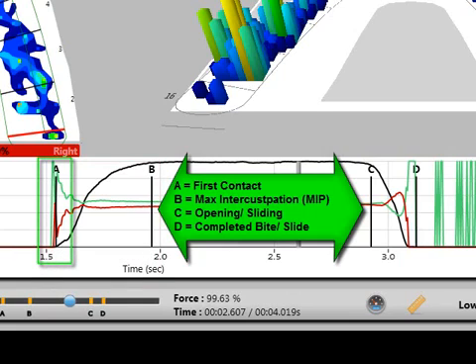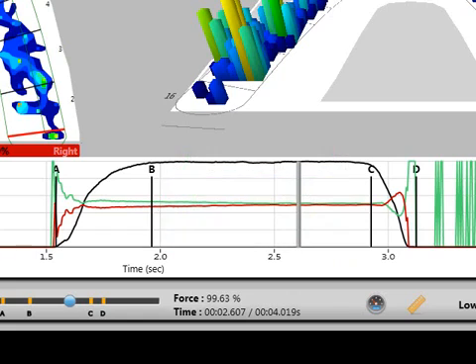The A line indicates when the bite has commenced. This line coincides with the black force line rising from the bottom of the graph. When the closure is complete, the black force line is marked with the letter B.